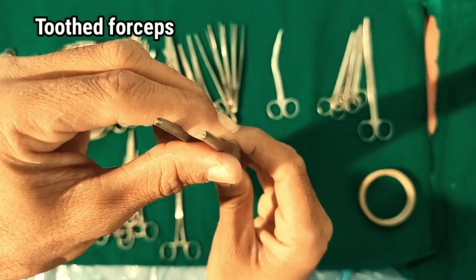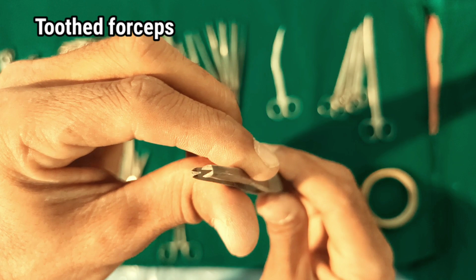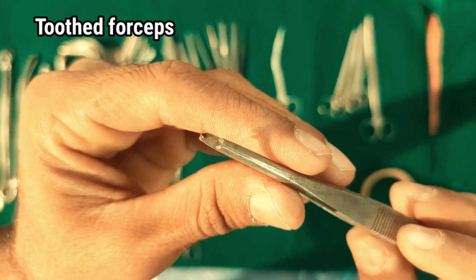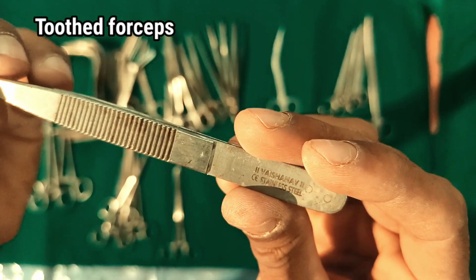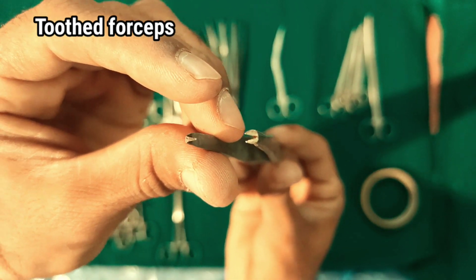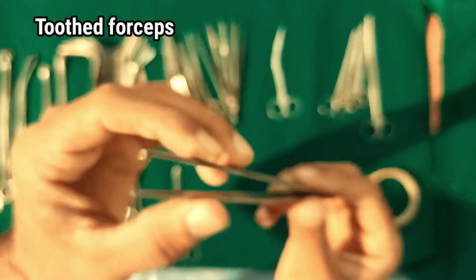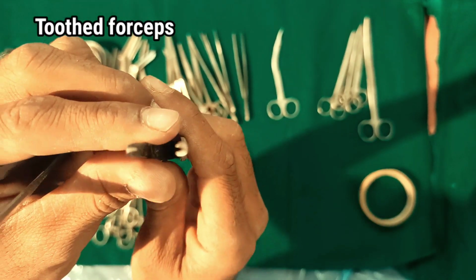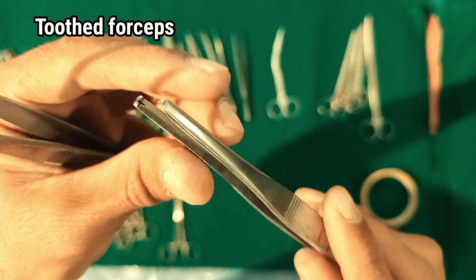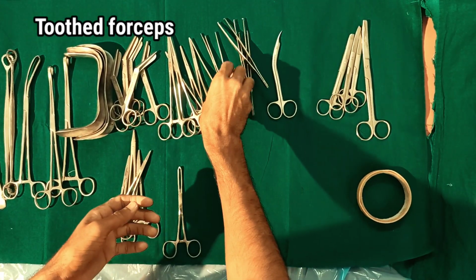Tooth forceps. Their primary purpose is to grasp, retract, or stabilize tissue. They may also be used to pack or extract sponges, pass ligatures, and stabilize and manipulate the needle during suturing. Forceps are categorized by the presence and type of teeth that are designed for the specific tissue they are intended to hold. Used for grasping and holding tissues, muscles, or skin surrounding a wound. Single tooth on one side, fits between two teeth on the other side. Available as 1 by 2, 2 by 3, or 3 by 4.